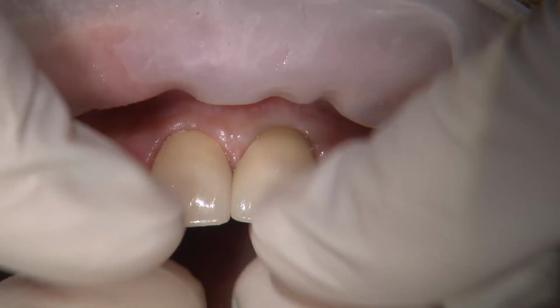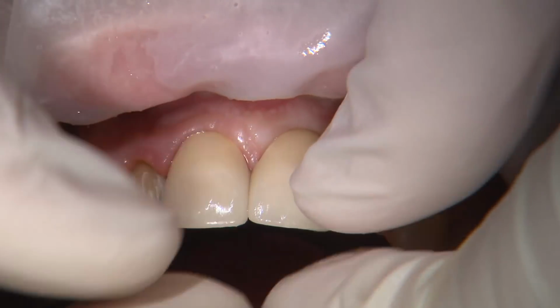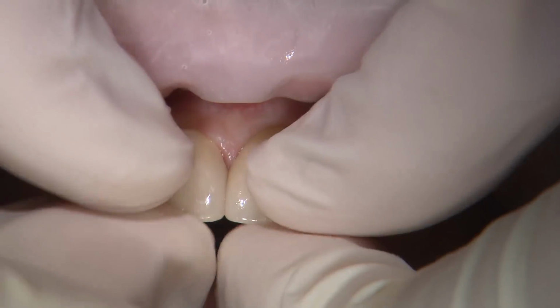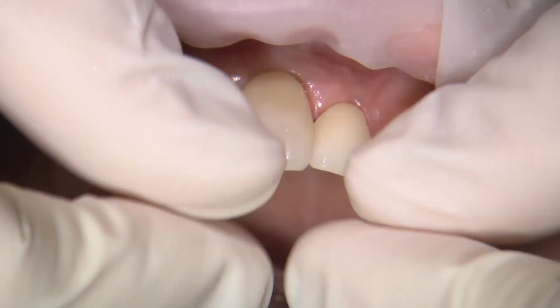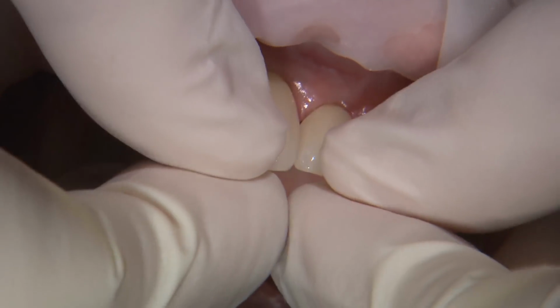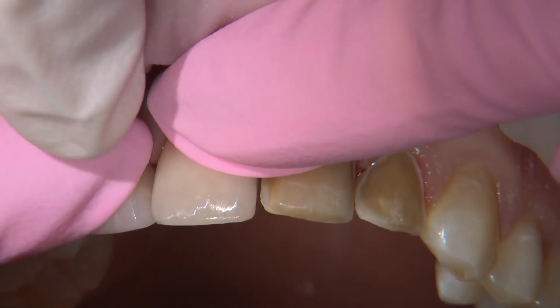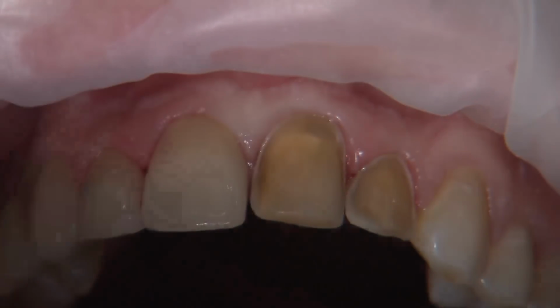With multiple unit cases, it's best to check the contacts against the adjacent non-prepared teeth first and adjust these as needed. Then check the contacts of your restorations 2 at a time. We want to verify that the margins of the restorations when seated together match the flushness as when we check them individually. If they're off in any way, then there is likely a heavy contact somewhere.